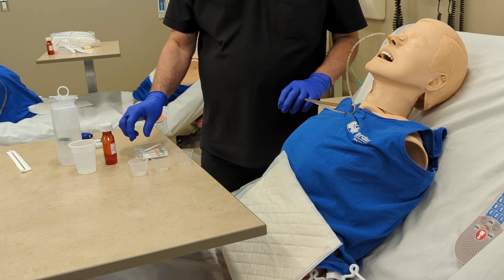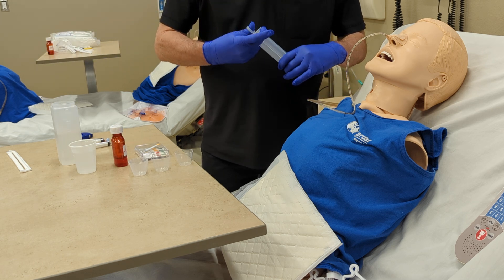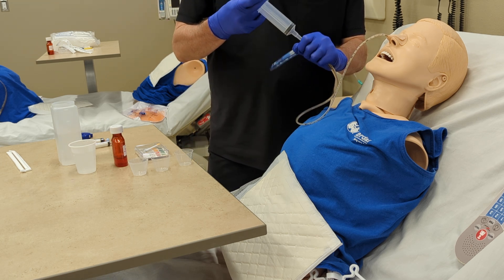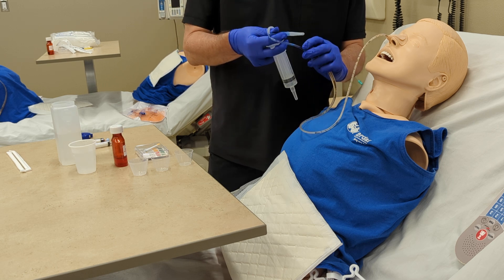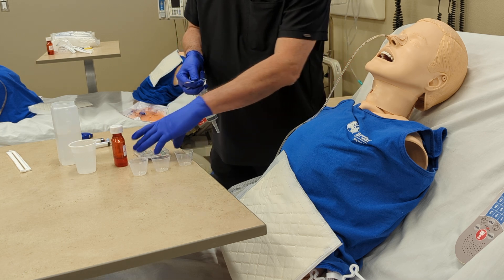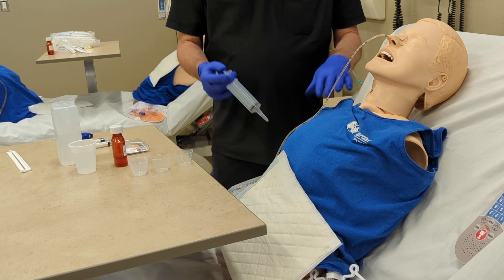The order is for acetaminophen, 200 milligrams. So in addition to checking the placement, we're going to go ahead and check the pH. Hold your syringe and manipulate it with your thumb — we're going to aspirate stomach contents, just a little bit to put on the pH paper. We verify the pH is good, within normal limits. So we've now verified by measurement and by pH.